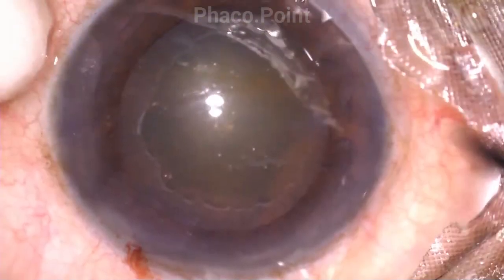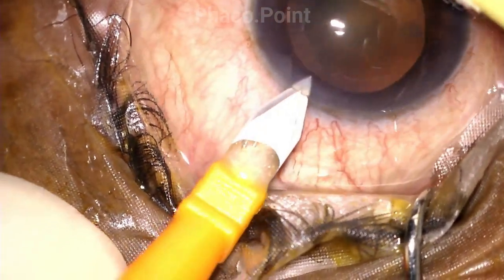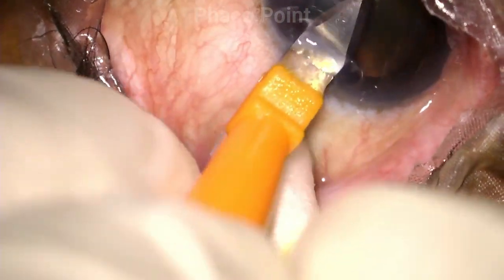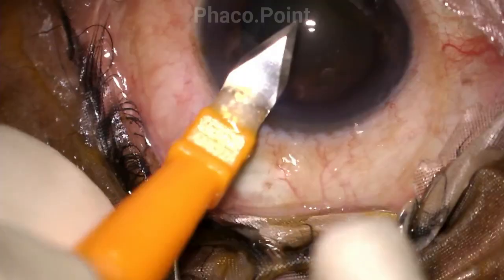This patient with pseudo exfoliation and a grade 2 to 3 nuclear sclerosis is posted for cataract surgery. Let's understand the instruments more closely. The 2.8 keratome remains quite standard. This is a biplanar clear corneal incision, and as long as the surgeon goes straight in and straight out, there's no question of any change in the width of the incision.